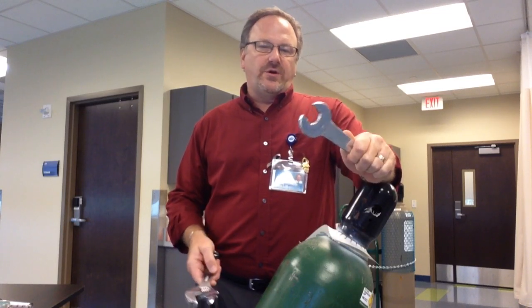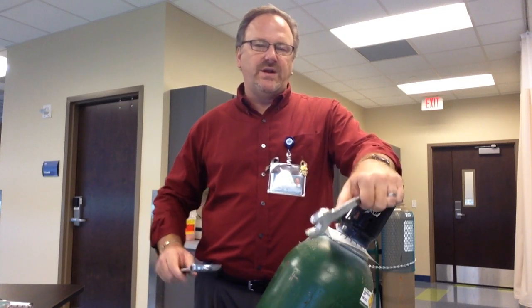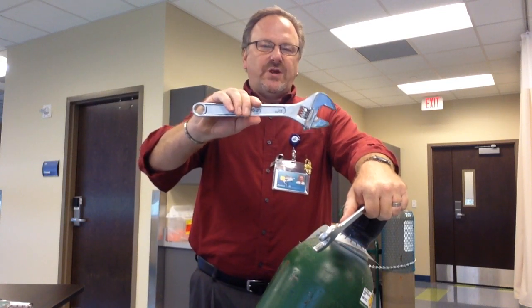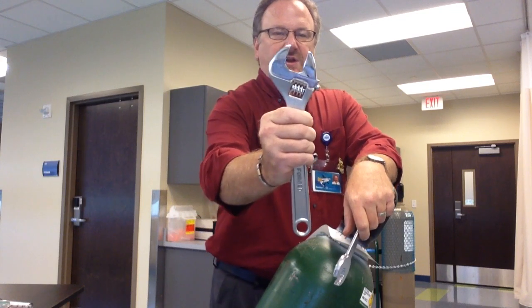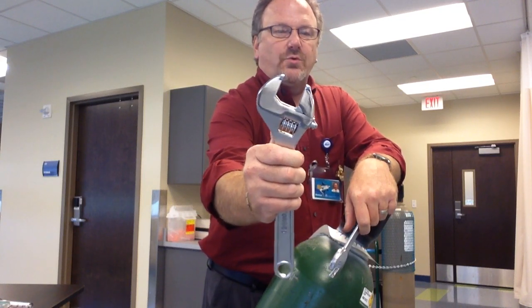Many hospitals no longer carry these — they've been lost throughout the years. So they'll have the standard adjustable wrench, commonly called a crescent wrench or adjustable wrench. You adjust it by just rolling.